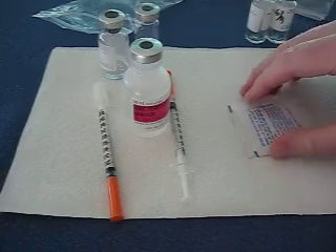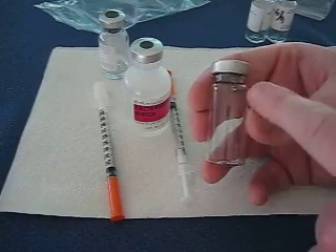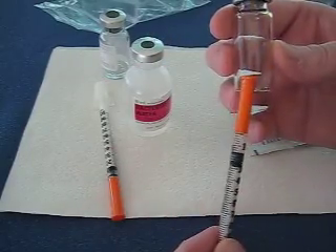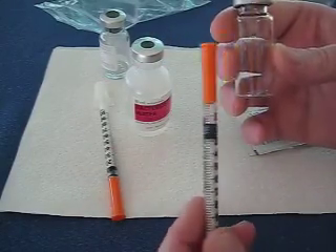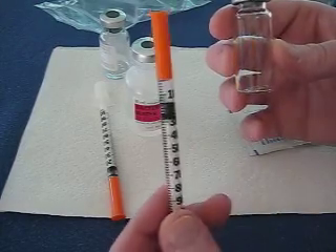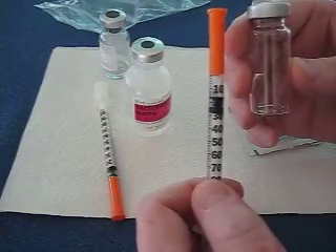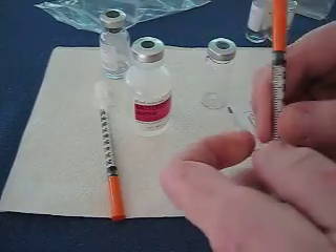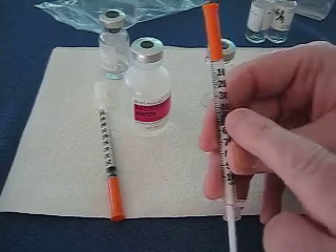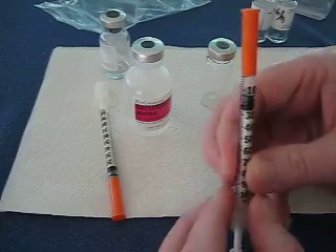If you look at the bottle, inside is atmosphere — air. When you take a needle and poke in there and take out fluid, the atmosphere is going to change. So what you want to do is keep the atmosphere balanced inside the container. If you're going to take out 50 units, you'll need to put in 50 units of atmosphere first. In my case, I do 15 units. This needle marks 10, 20, 30, 40, and so on — so I go in between the 10 and the 20, and that is 15.